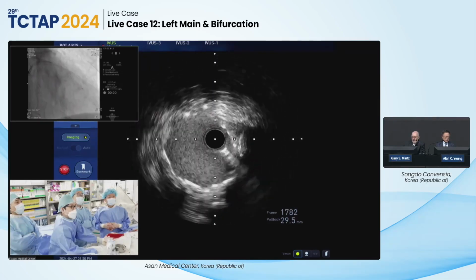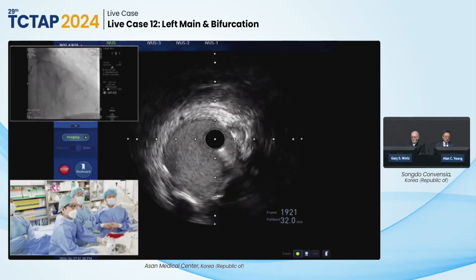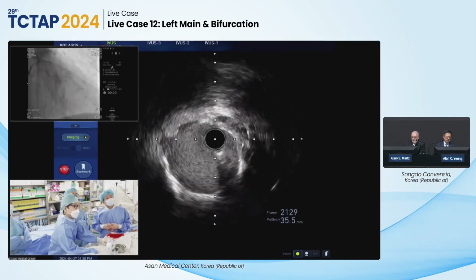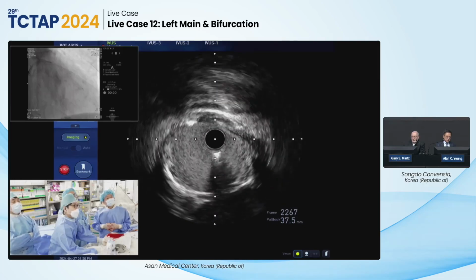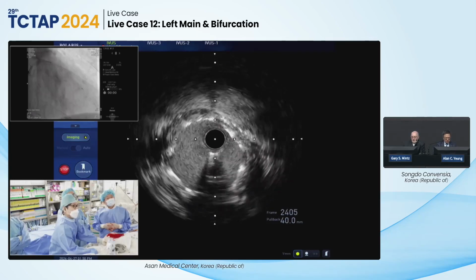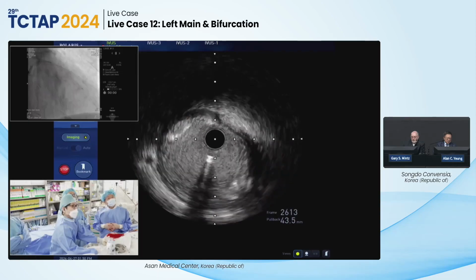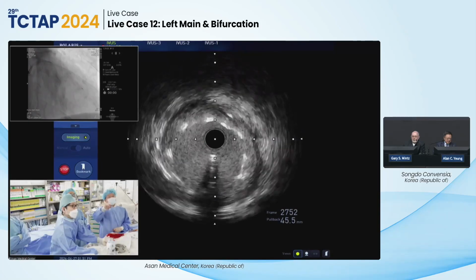Now into the distal left main. Stent apposition is good, right? Yeah. So far, the left main minimal stent area is good. It's what, 1, 2, 3 to 4, so it's somewhere in the 9 to maybe 10, 11 square millimeter range. And then we look at the proximal edge. Good landing zone.